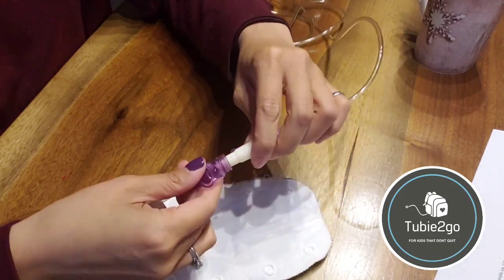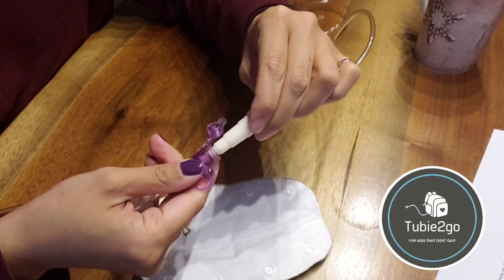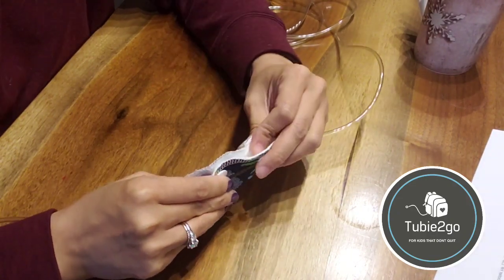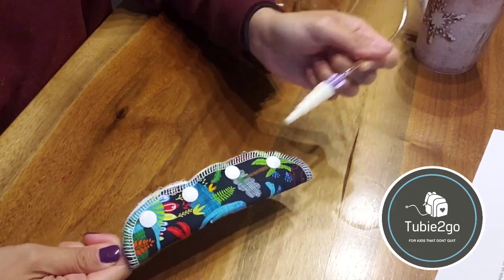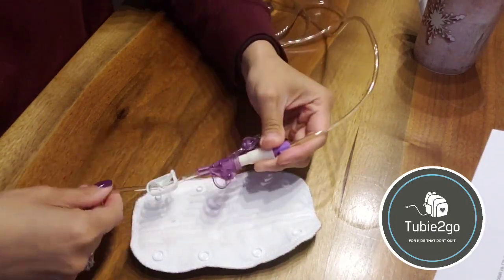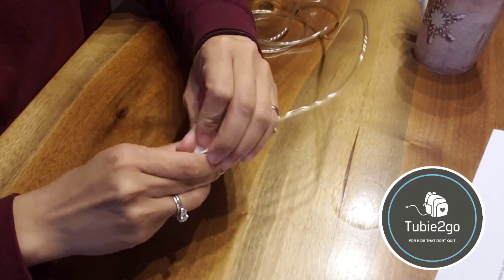But again, as I mentioned, if your ports are coming undone just because they're not staying in firmly, or if your tubie is going to be yanking on them and it's not properly secure, you're going to see that a port cover is probably not going to be the solution that fixes your problem. So here I have it loosely connected, and you can see it's still going to come apart. So for that reason, for disconnecting ports, you'll probably want to consider a different option. But a port cover is going to be one of the easiest and cheapest options to consider, depending on why it is your ports are disconnecting.